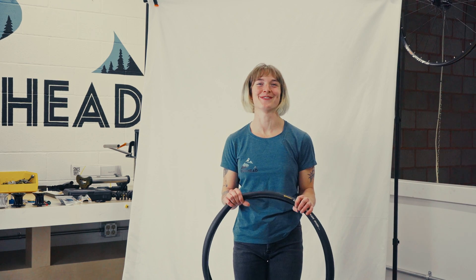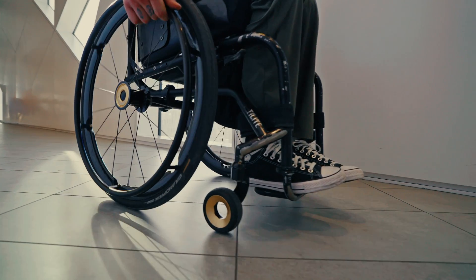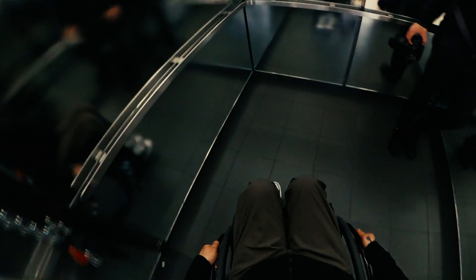Key feature number four is where rubber meets the road. Bowhead has partnered with Continental to bring you the best in tyre technology. We offer the Continental Gator Skin as our standard tyre, coming in at 325g, and our upgraded option, the Grand Prix, has been written into cycling history.